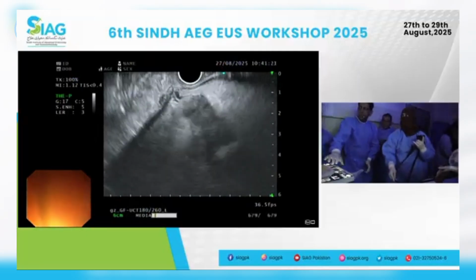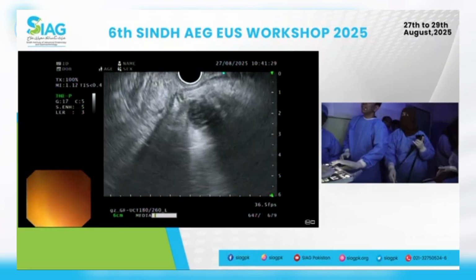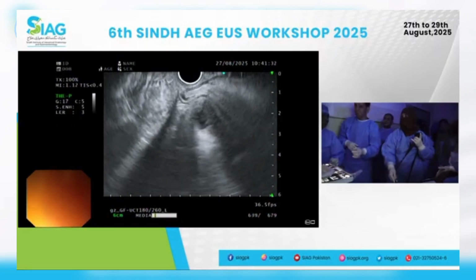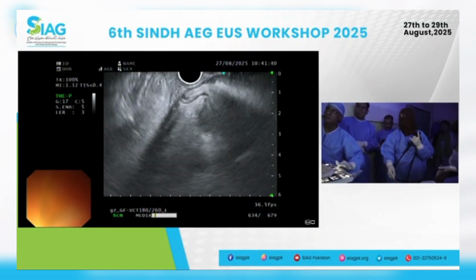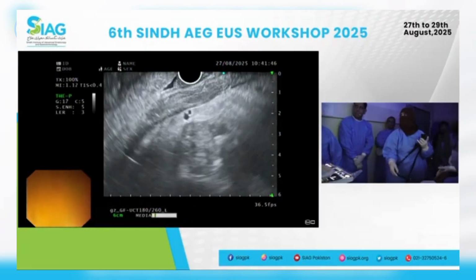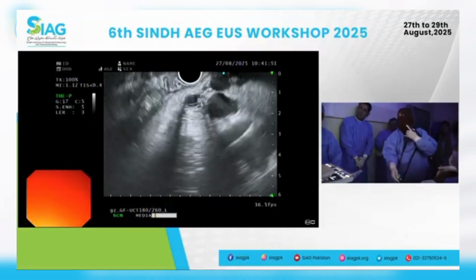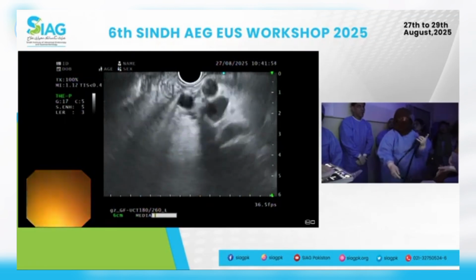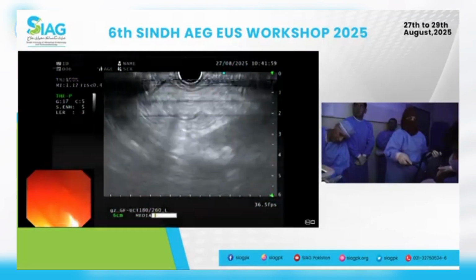What are you seeing here? Let me freeze there. इसको थोड़ा सा पीछे कीजिएगा भाई. We briefly saw the stent. Okay, in that case we'll go to the D1. हाँ इसको unfreeze कर दीजिए. We just had a brief look at the PD stent. That's fine. Let's go into the D1 then. Endoscopic image बड़ी कर दीजिएगा, please.